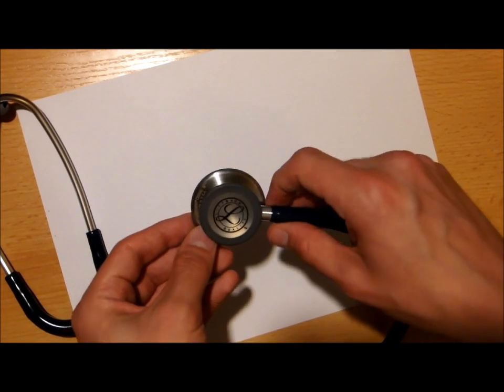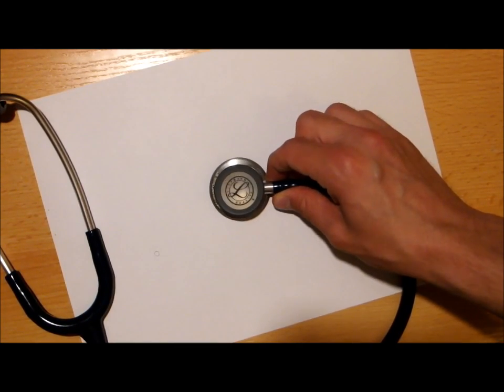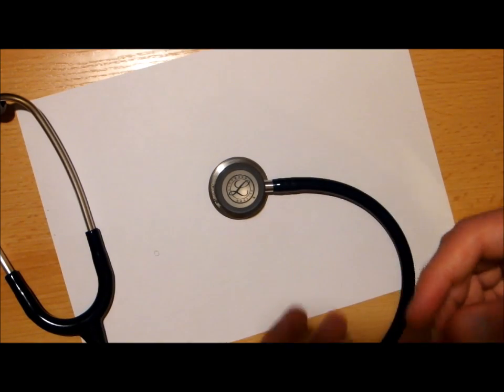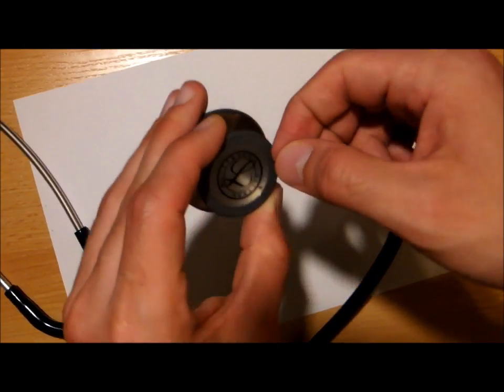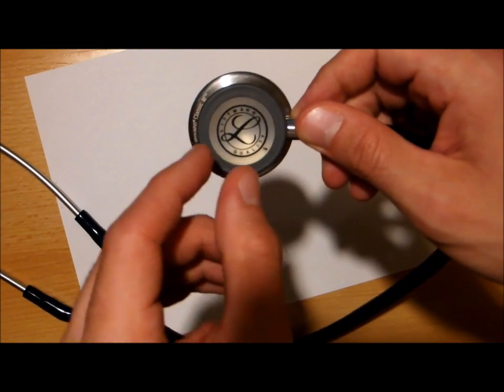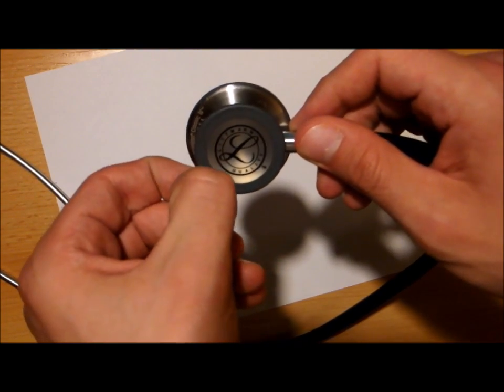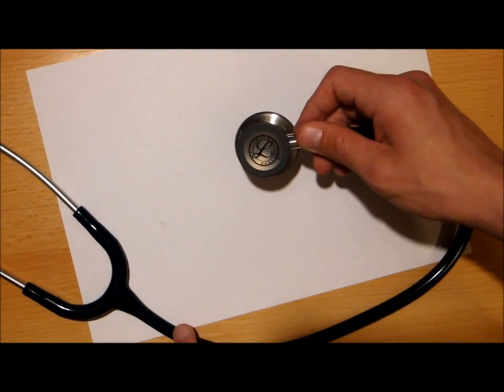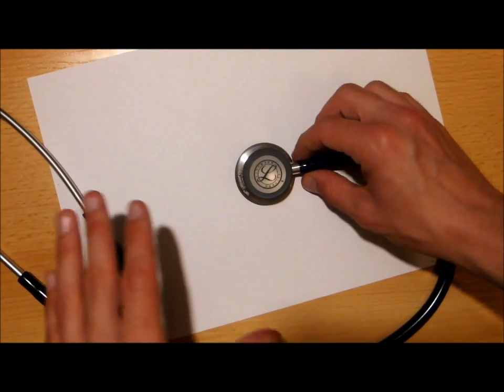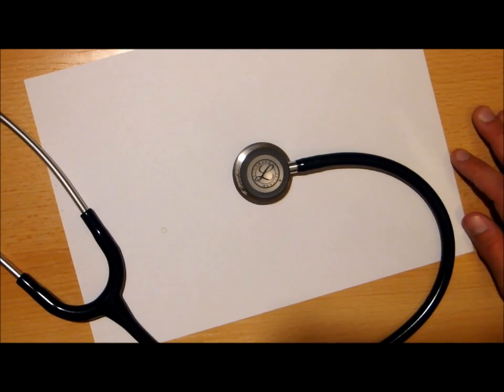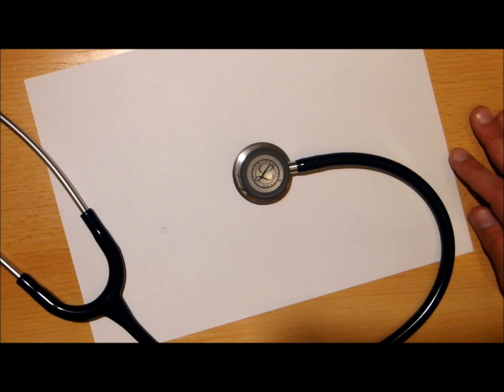The instruction manual said that it is easy to be done by just pinching the rim of the gum diaphragm and just peeling it off, and so said the YouTube videos, the official Littmann YouTube videos that I saw, but none of those methods worked for me actually.